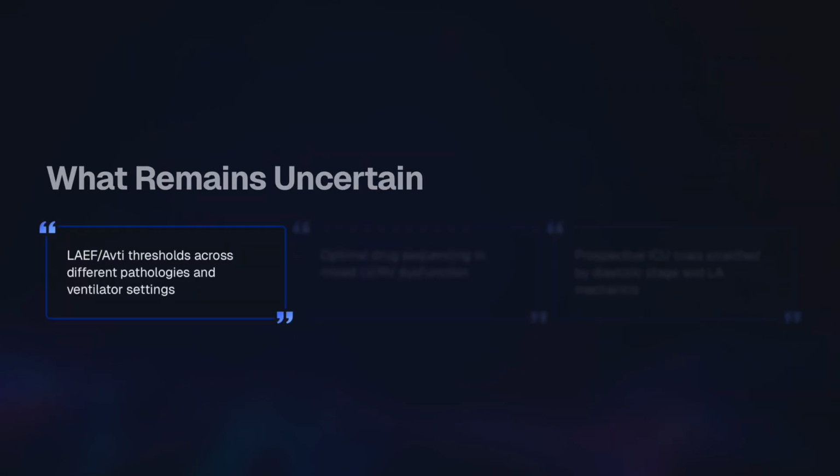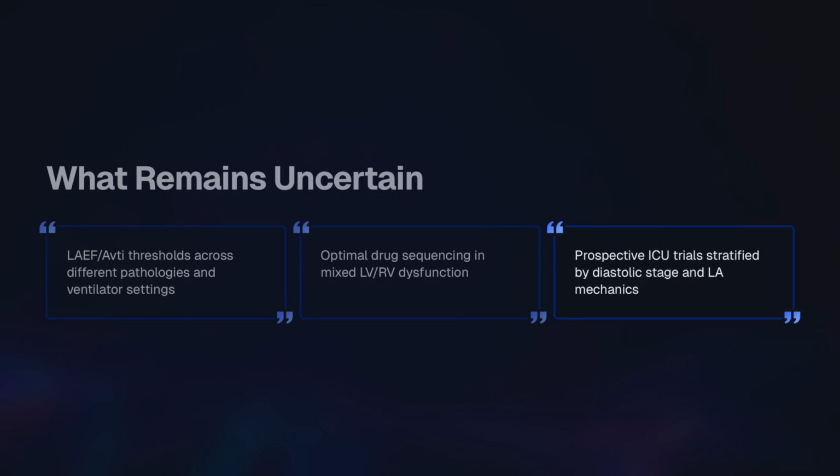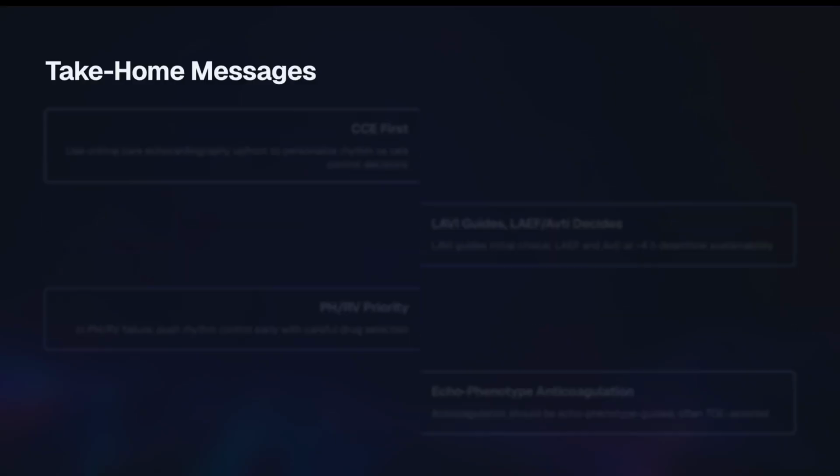What remains uncertain is that the LAEF and the AVTI thresholds across different pathologies and ventilator settings are unknown. Optimal drug sequencing is not known. We don't know how to sequence it if there is a mixed dysfunction. Prospective ICU trials stratifying by diastolic stage and LA mechanics are not yet done.